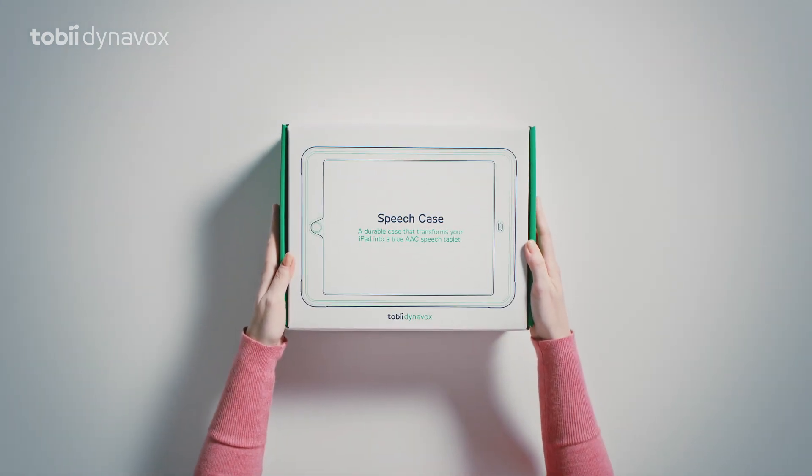Good thing it's durable. Today we will be unboxing the new speech case. It's a really useful tool for people with speech and language disabilities.